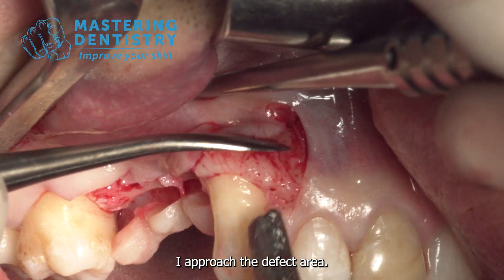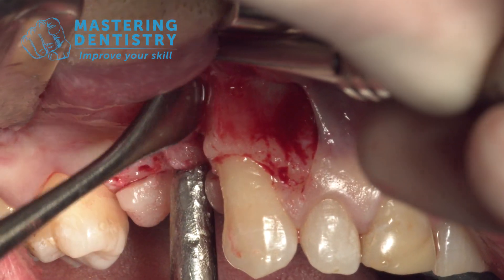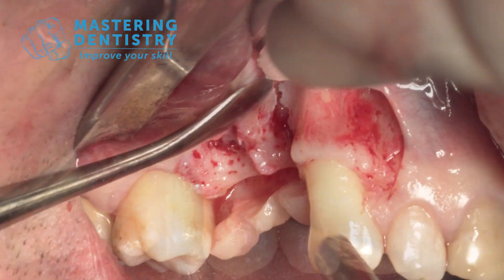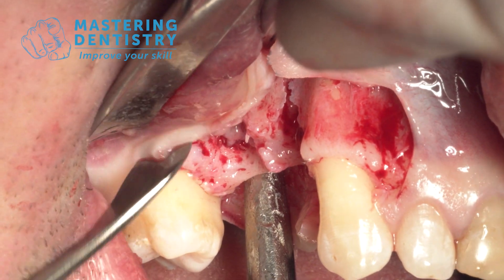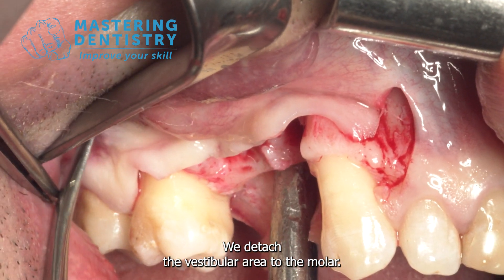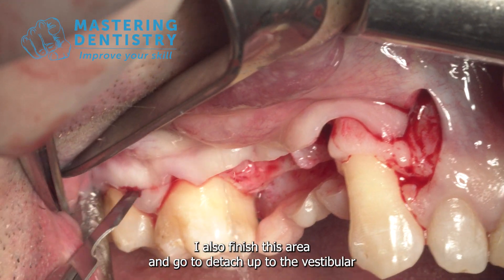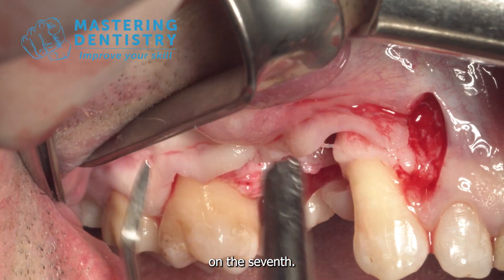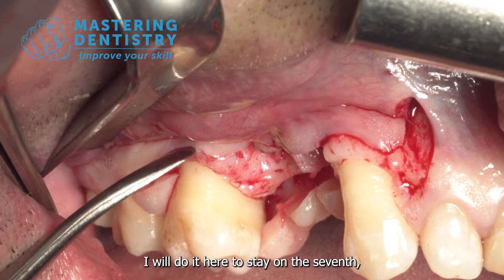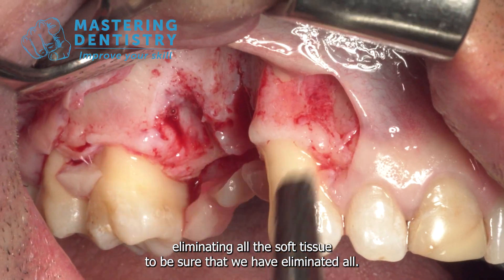I approach the defect area, looking for the apical part of the defect and also in the distal area. We detach the vestibular area to the molar. I am going to open the papilla already because I know this mobilization will not be enough. I also finish this area and detach up to the vestibular on the 7th. If I need a discharge I will do it here to stay on the 7th. We increase the detachment toward apical, eliminating all the soft tissue to be sure we have eliminated all.